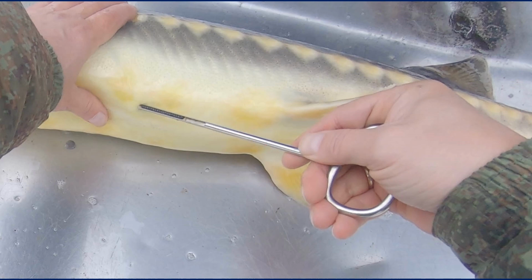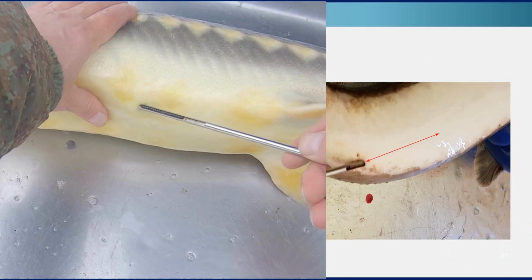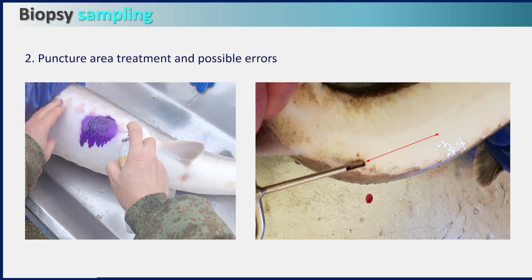The extracted eggs are placed in cuvettes with cavities or in tubes separately from each female, and then processed in one way or another. After taking the sample, in order to prevent infection, it is necessary to treat the puncture area with any antiseptic for external use. In the absence of special means, a concentrated solution of methylene blue or a 0.1 to 0.5% solution of potassium permanganate can be used as a disinfectant.